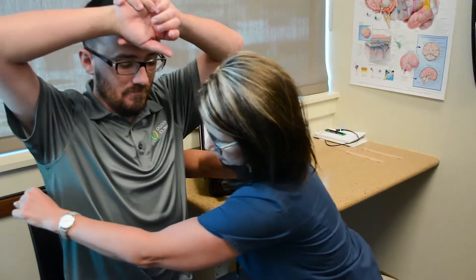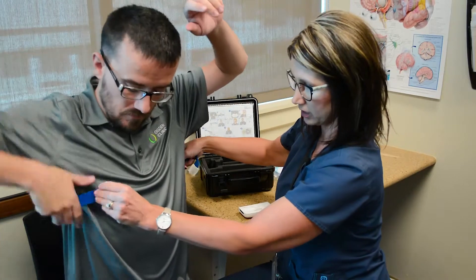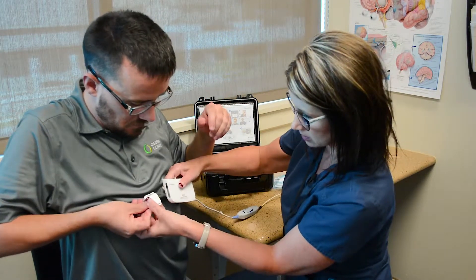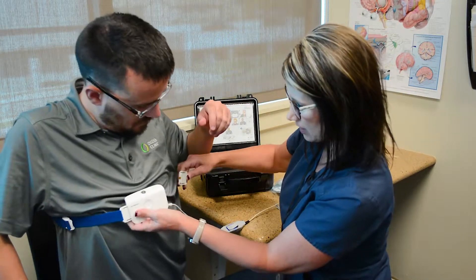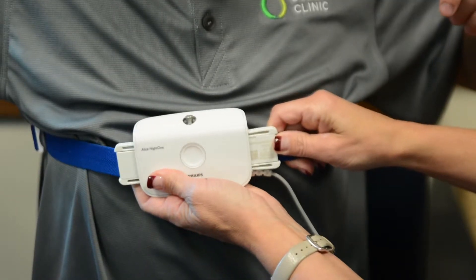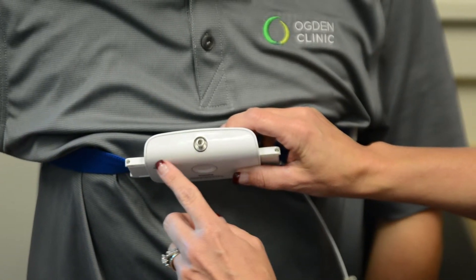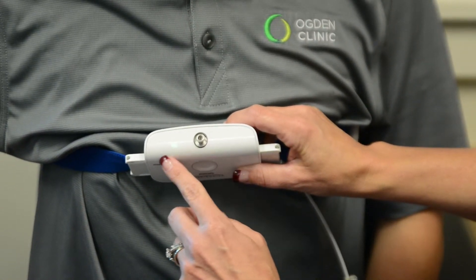We're just going to wrap it around your diaphragm. I'm going to have you hold over here on this end, and then we're just going to connect it to each end. Once you connect it into each end, that's also what turns on the machine. We'll know that the machine is on because we have these lights up here at the top.